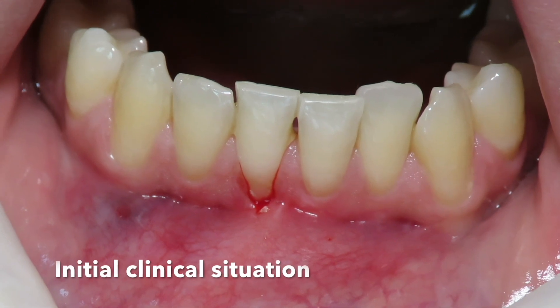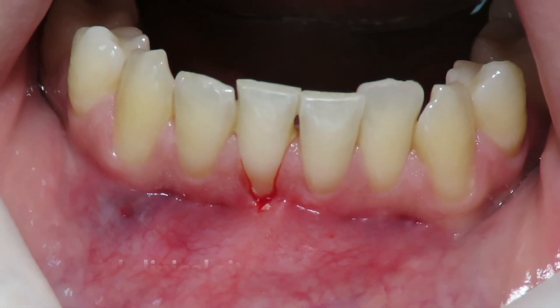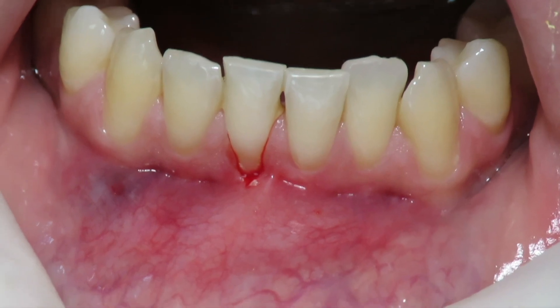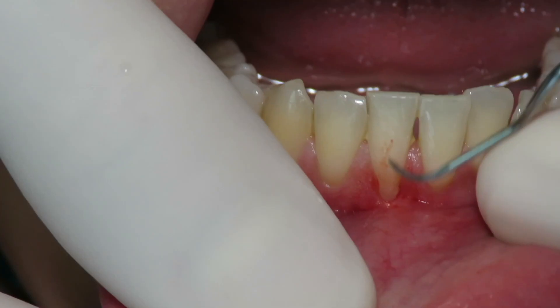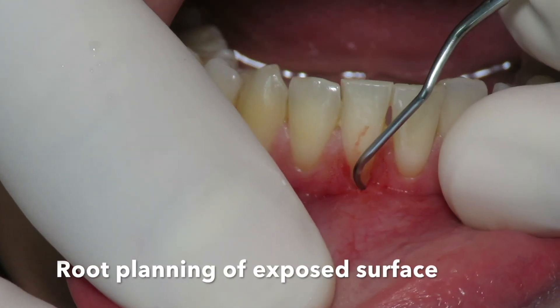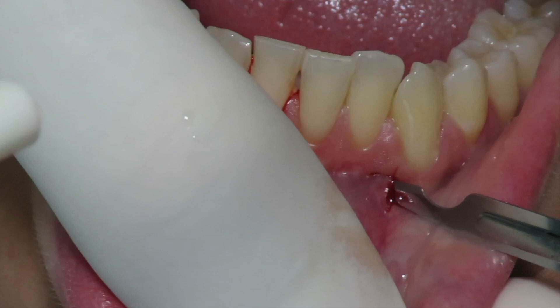The initial situation presents as a Class 1 Miller recession on a central incisor. We first started by curettage and root planing the exposed surface of the tooth.